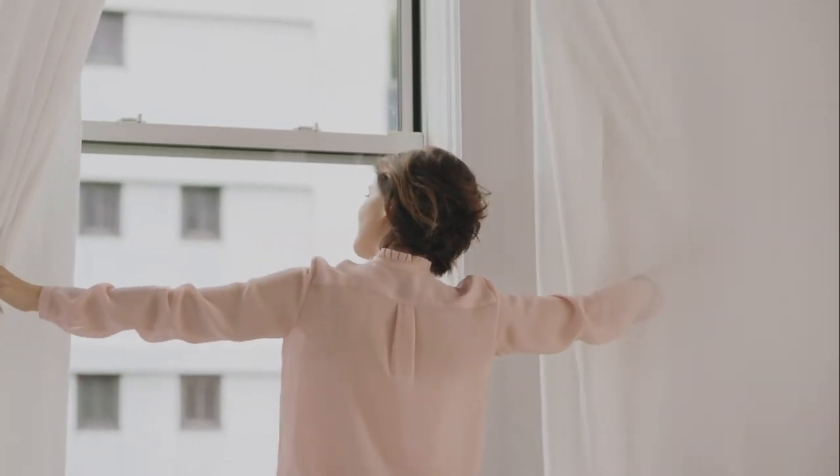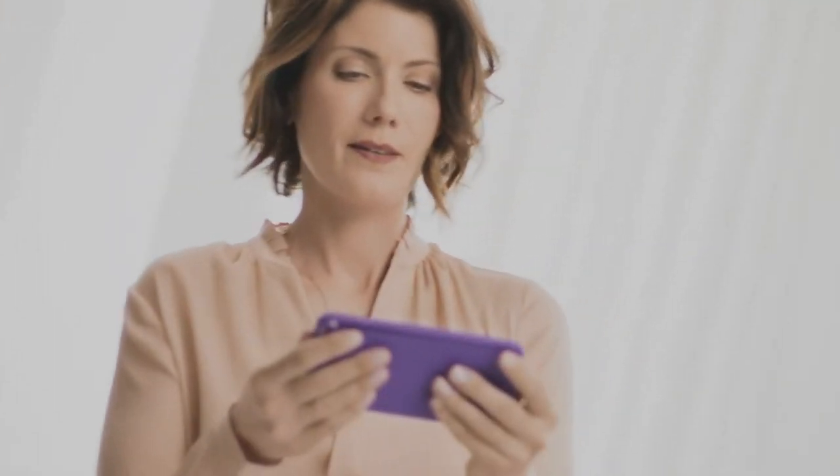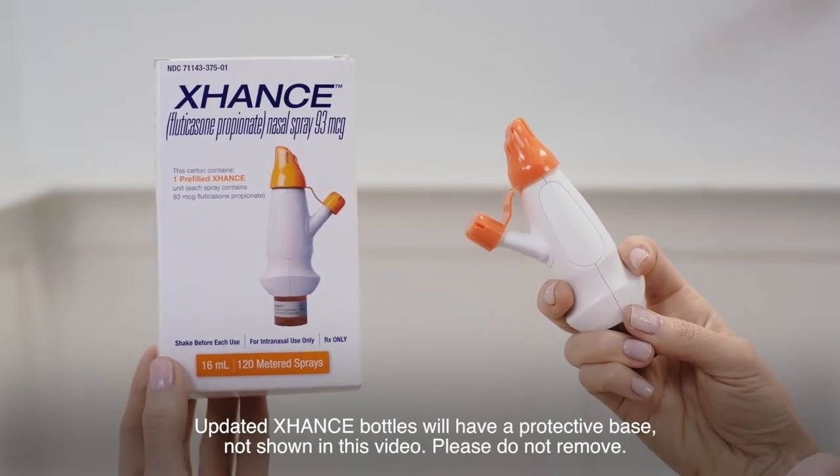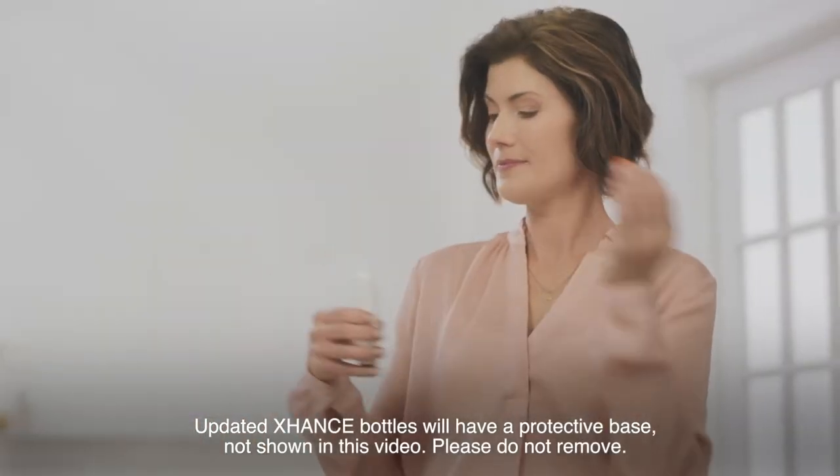Today is Megan's first day trying Exhanse. Glad you're here for it. You see that? You blow instead of sniff. That's easy enough, right? Let's take a closer look at how to use Exhanse.